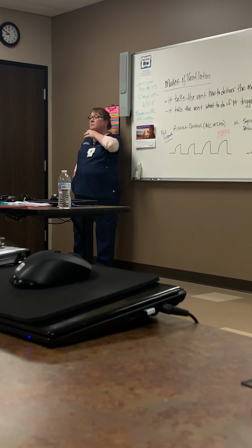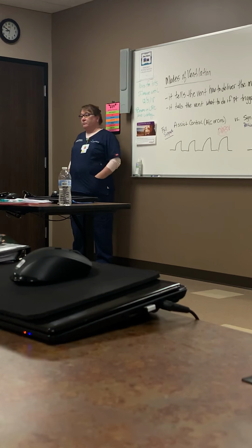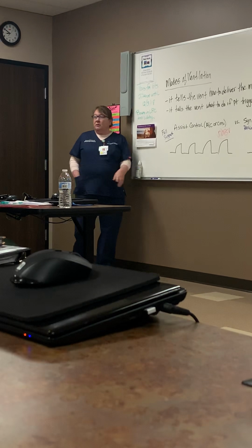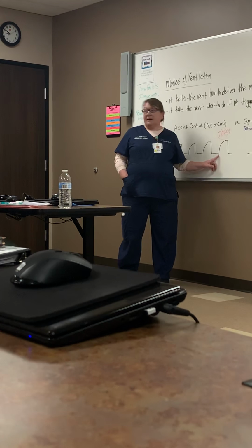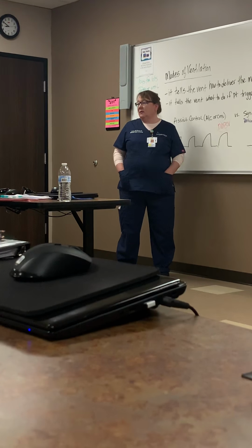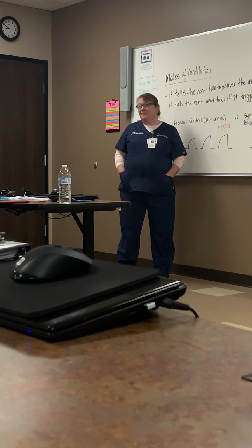Nick? Just a quick question, on assisted control, if they start to try and breathe by themselves, is there an alarm or something that goes off so we can switch them to partial support, so they can start breathing a little bit? No, you'll see with all the negative deflections, you'll know that they're initiating every single breath. Okay, and that's when you would switch them to try and wean them if you can see that they're constantly trying to do a breath?